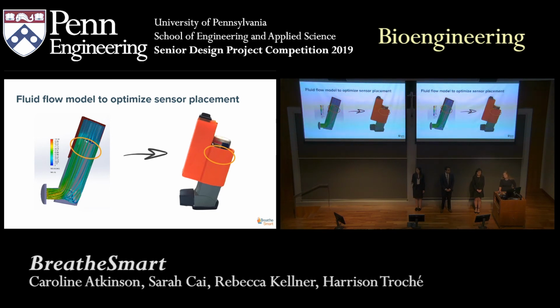And then there's a small hole around here that has a tube that connects to the pressure sensor and reads the pressure inside of the inhaler. So the sensor and all the electronics are housed in this body, and the tube connects right in the center and reads the internal pressure. It goes to the top where it's open. So there's a hole on the inside. But that canister, it doesn't puncture? No, it doesn't. There's a gap between the canister and this outer plastic casing, and that's where we're measuring the pressure.